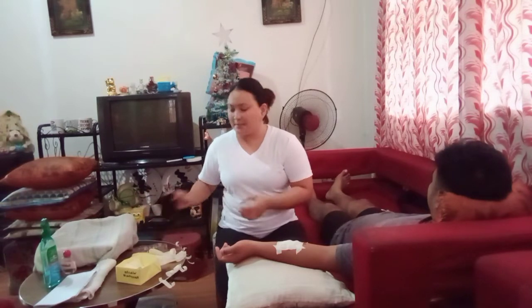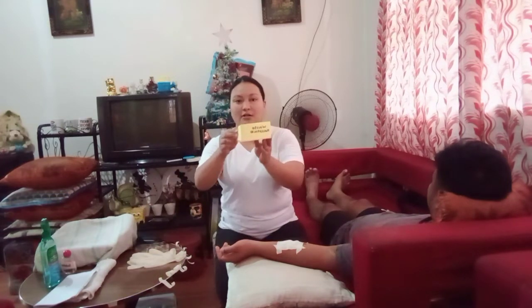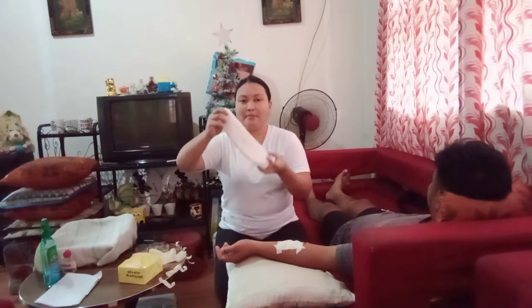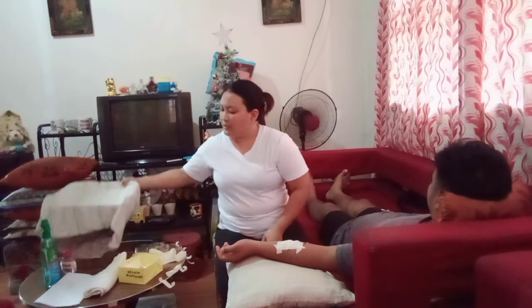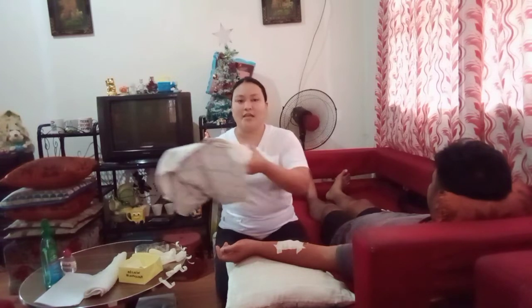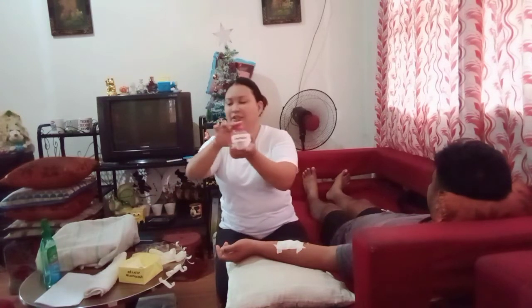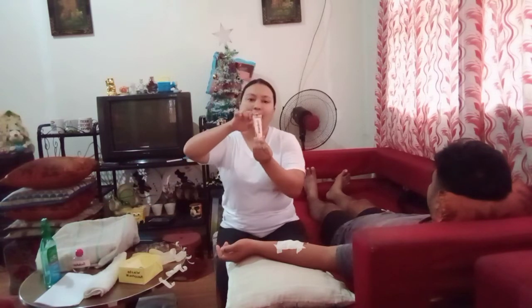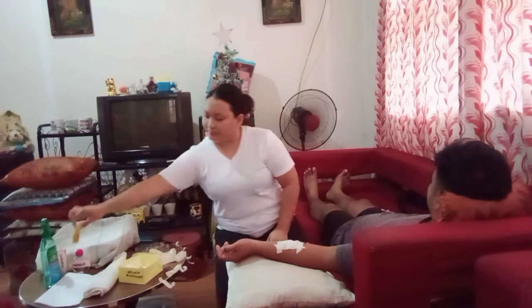So this is my face mask, my eye protection gear, the tapes, waste receptacle, draping blanket or draping towel, the sterile dressing tray, the solution, ointment, antiseptic, and by the way, what is inside the sterile tray.